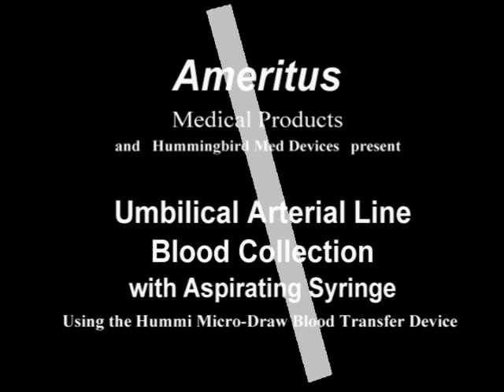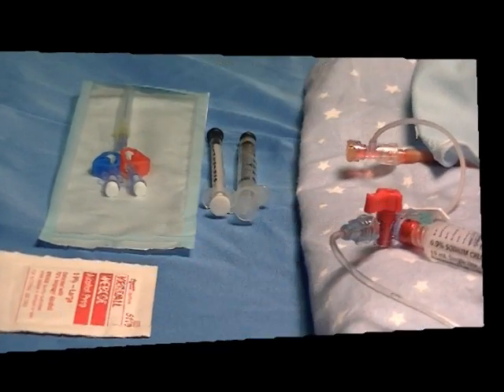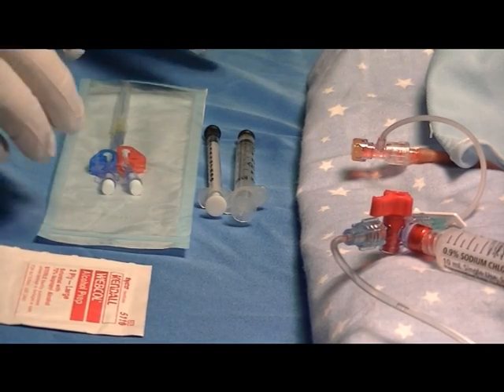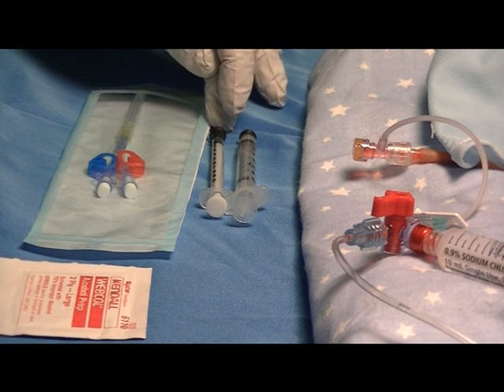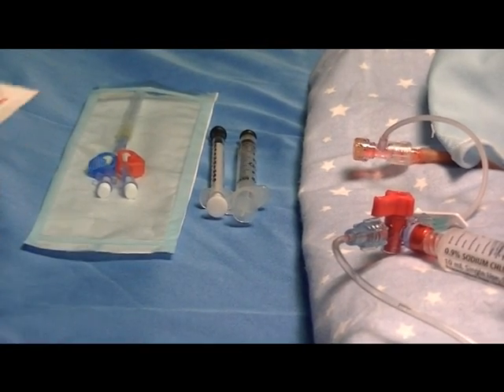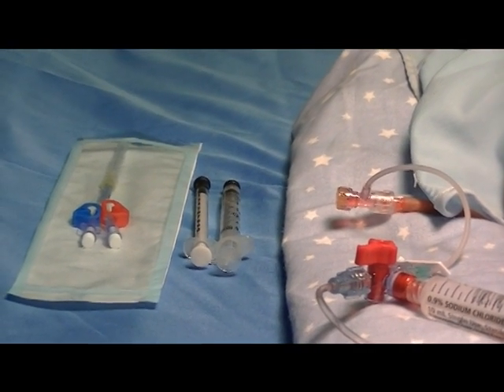This will be a demonstration of the Hummey Microdraw blood transfer device for an arterial blood sample from an umbilical artery catheter using aspirating syringes. First, gather the appropriate materials: the Hummey Microdraw device itself, a 1 ml blood gas aspirating syringe, a 3 ml aspirating syringe, and the appropriate prep material.